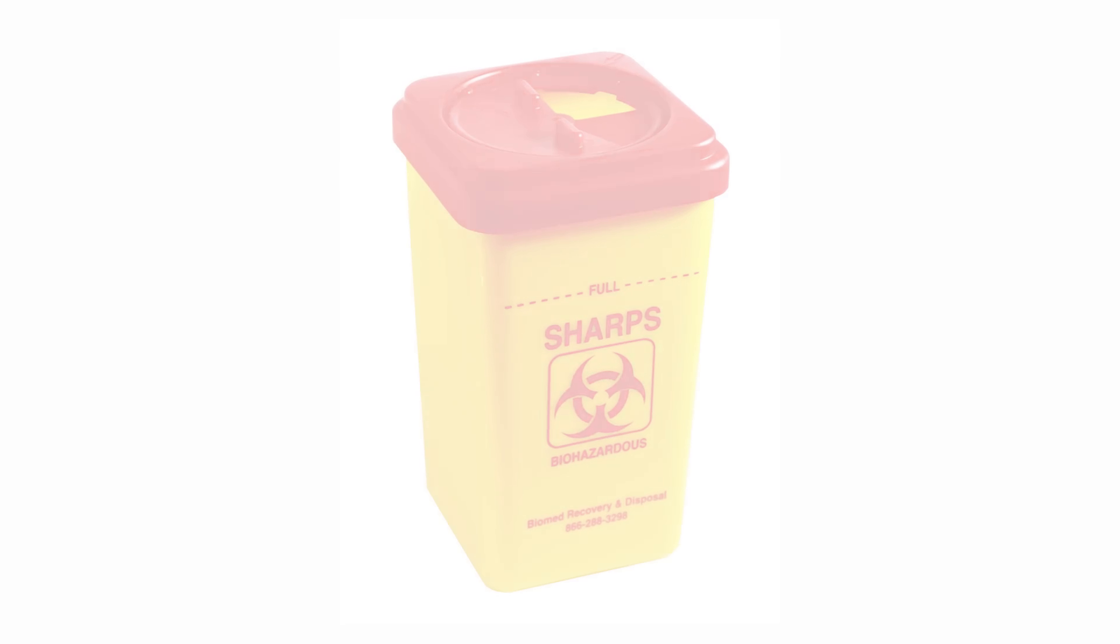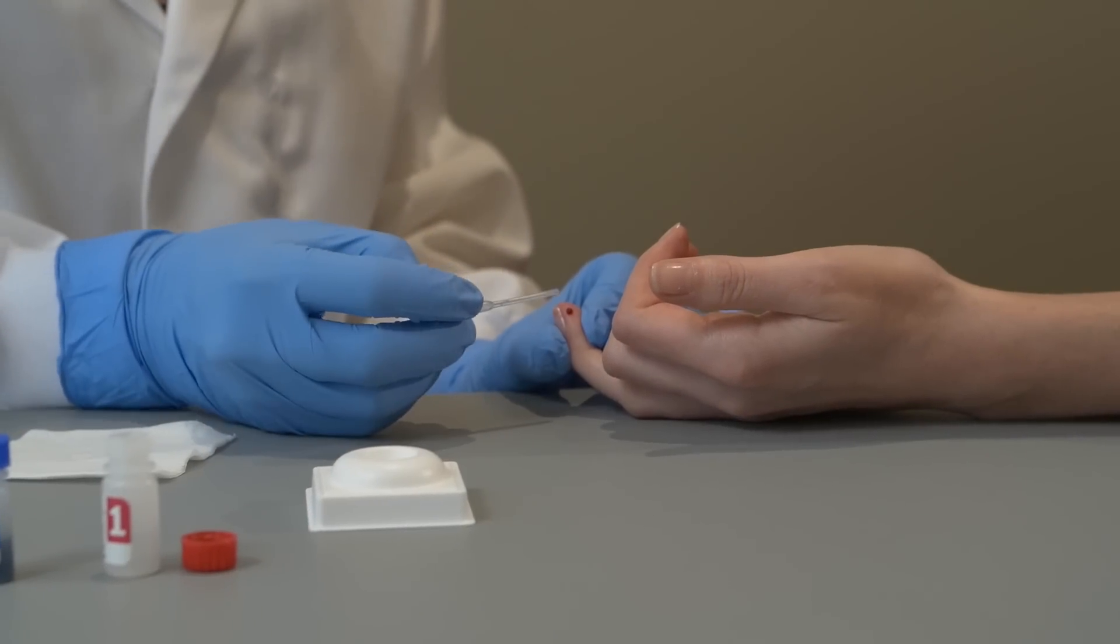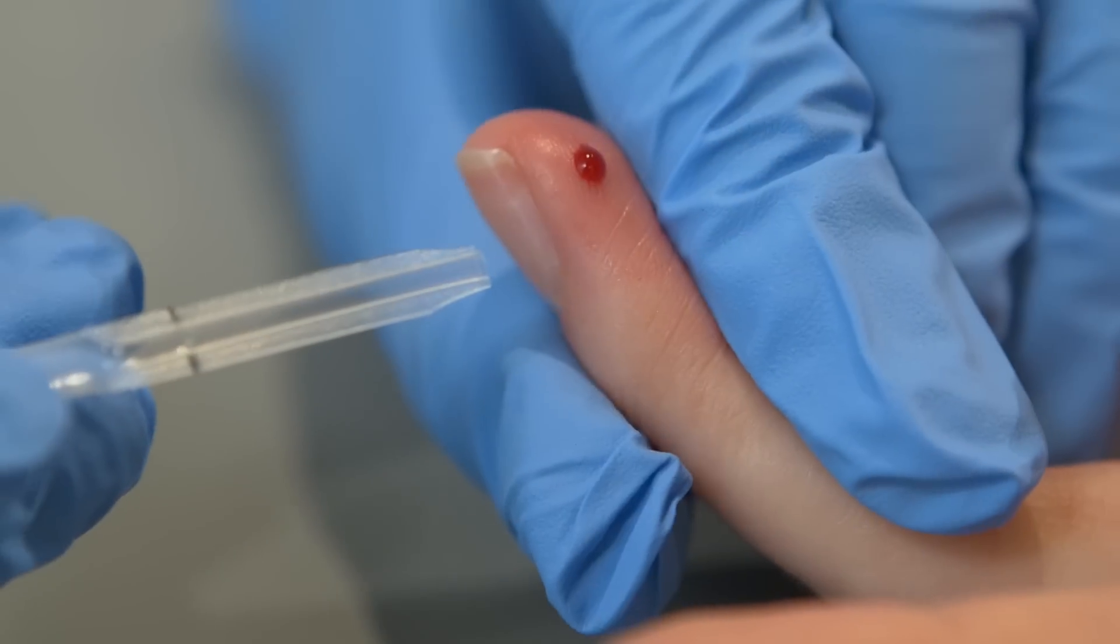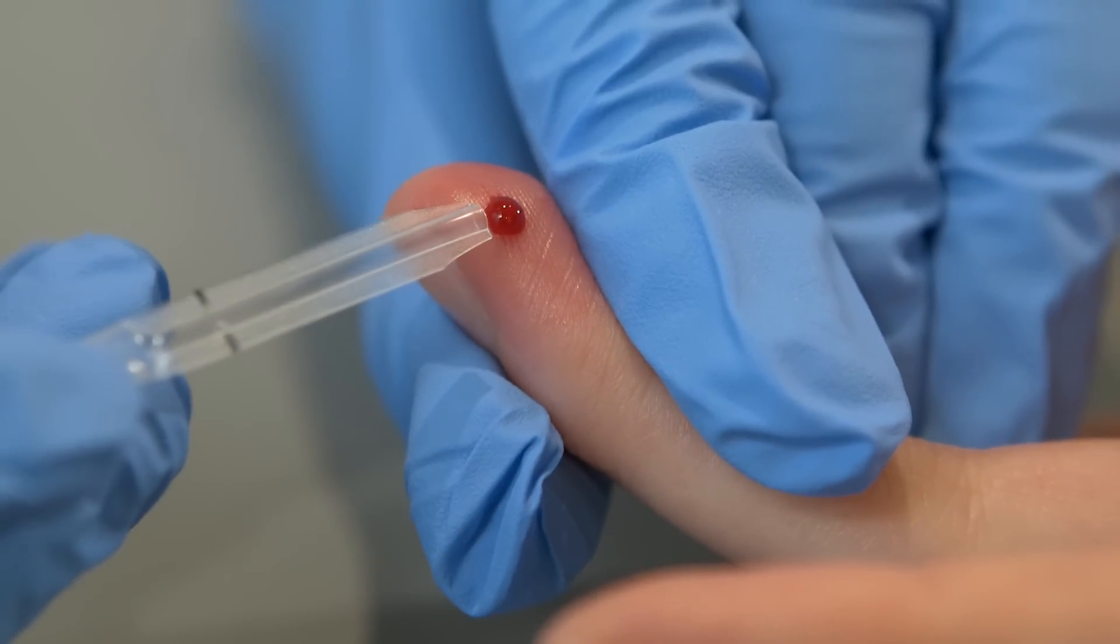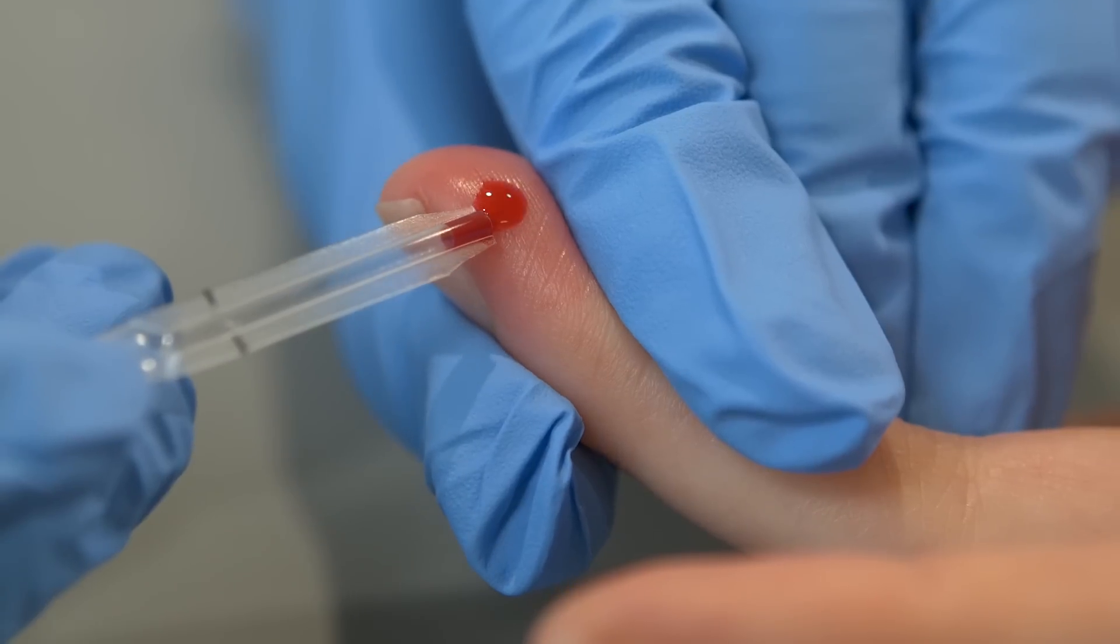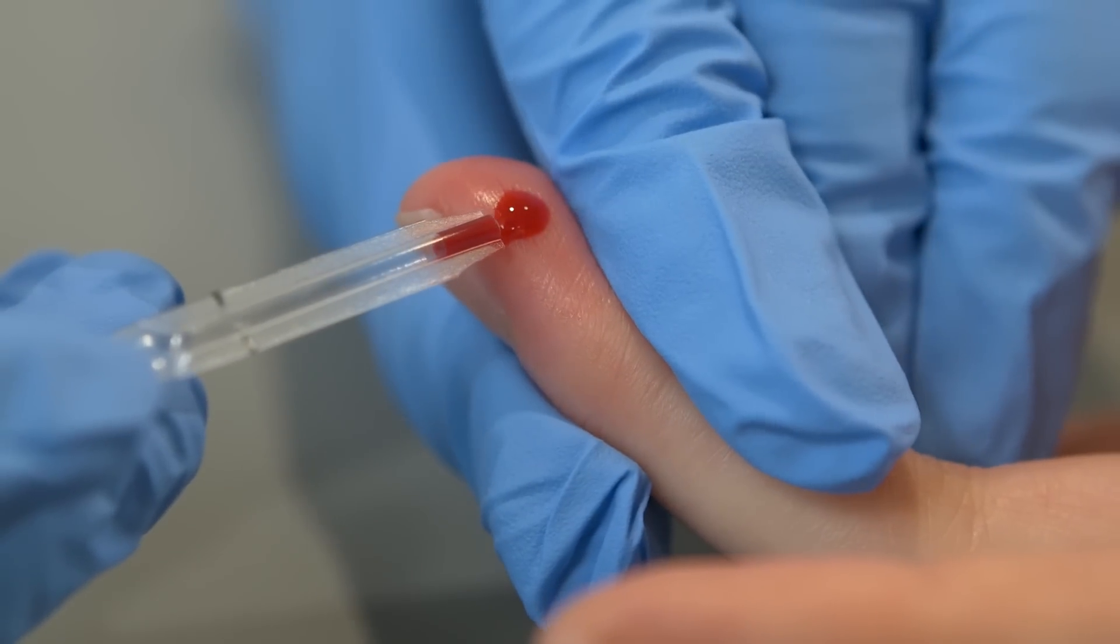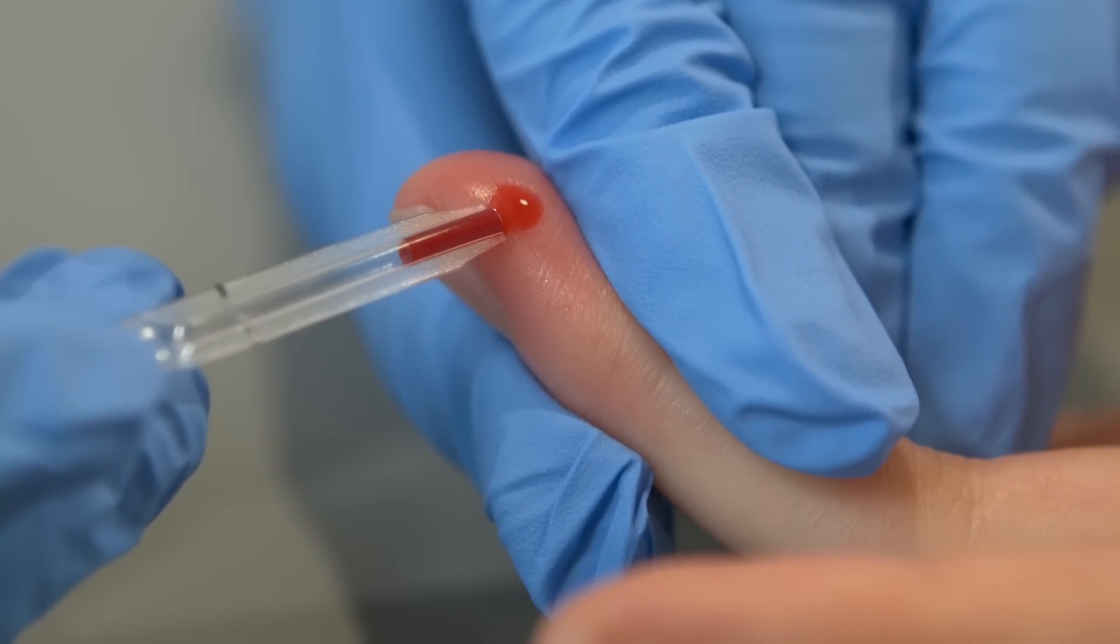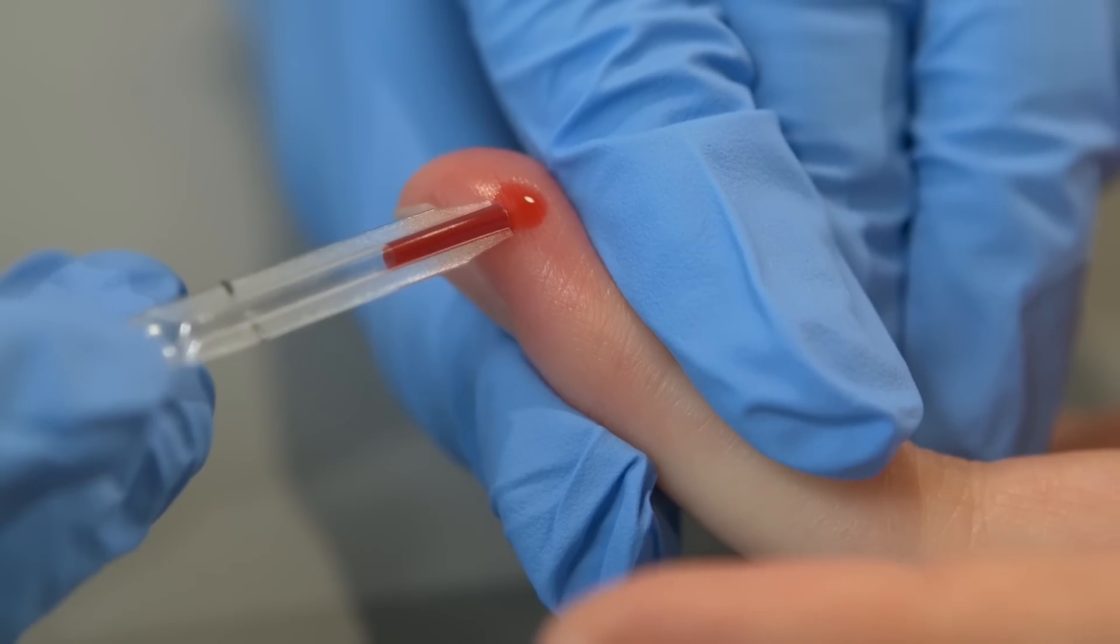Do not squeeze blood from the finger until you have the pipette ready in hand for collection. Lightly squeeze the finger in one motion towards the tip to release a bead of blood. With INSTi, the first drop of blood does not need to be wiped. Hold the pipette horizontally and carefully touch the tip of the pipette to the bead of blood.